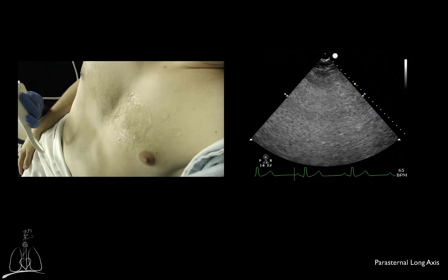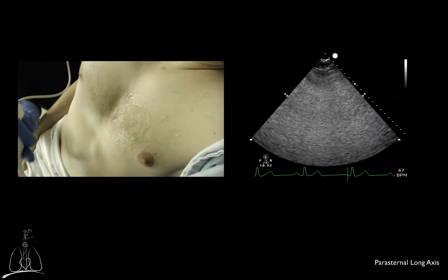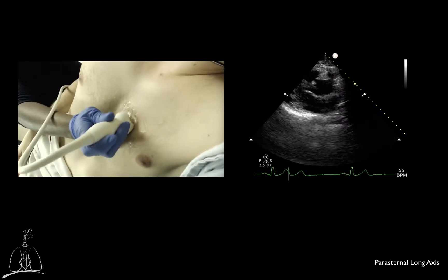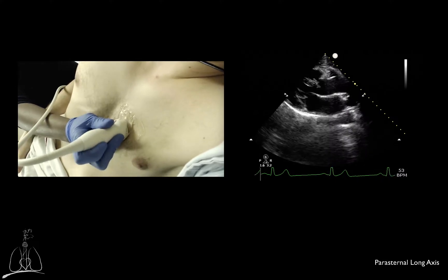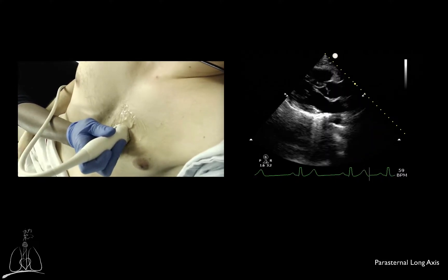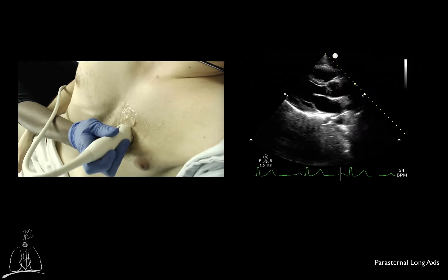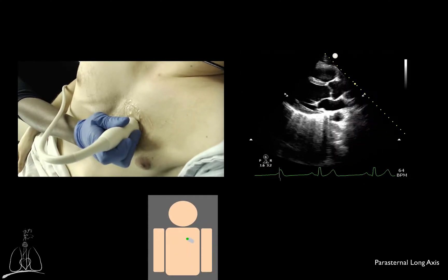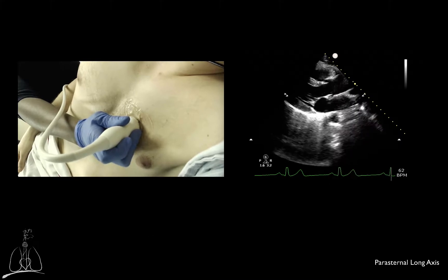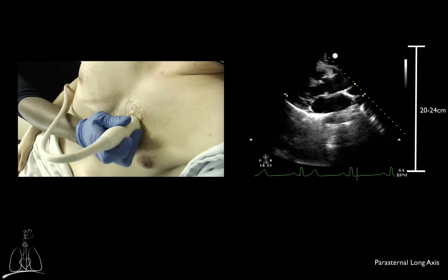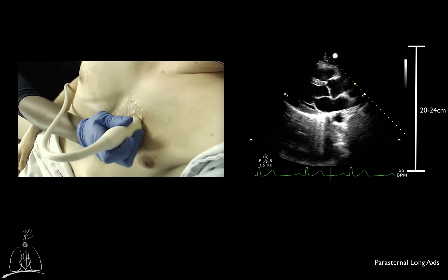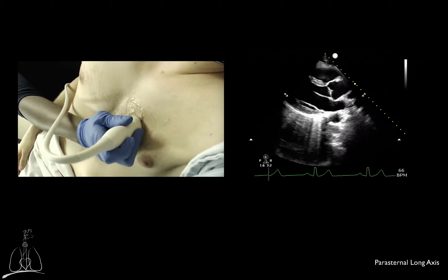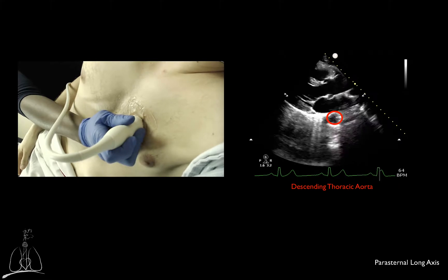The parasternal long axis view can be obtained by placing the probe between the second and fourth intercostal space along the left parasternal border, close but not over the sternum. The transducer indicator should be pointing toward the patient's right shoulder. Always start setting the depth at 20 to 24 centimeters. This will allow adequate assessment of possible presence of left pleural or pericardial effusion as well as descending thoracic aortic pathology.